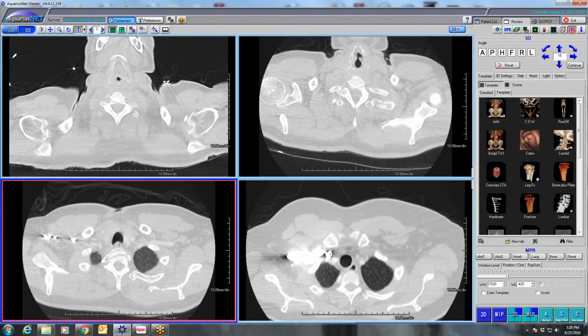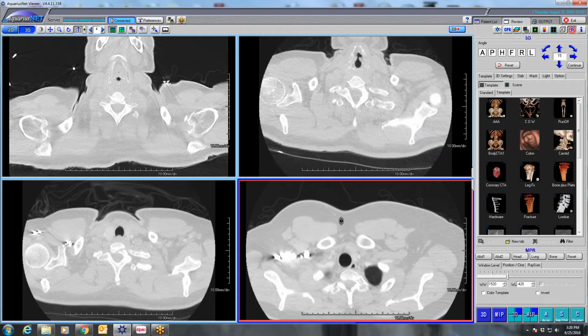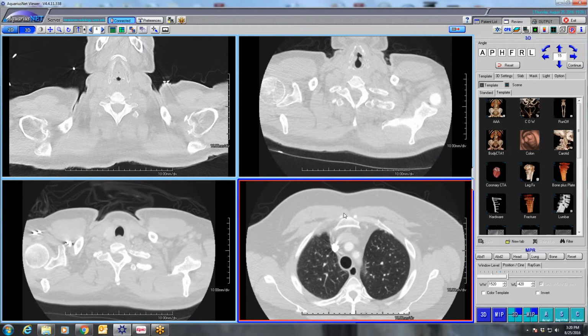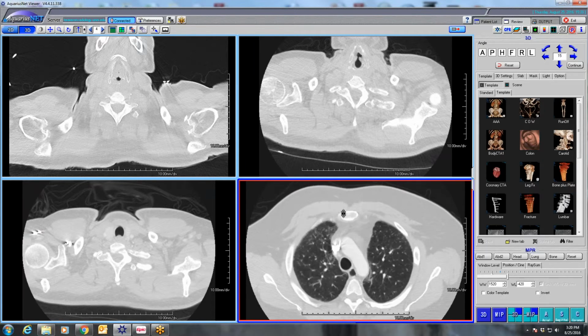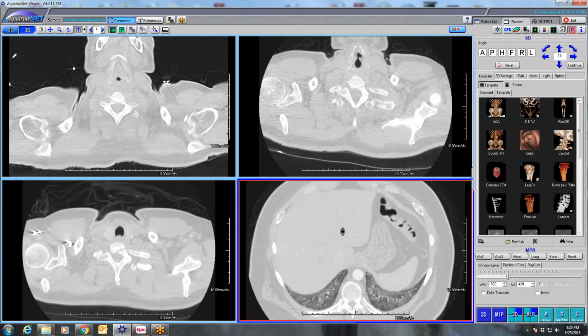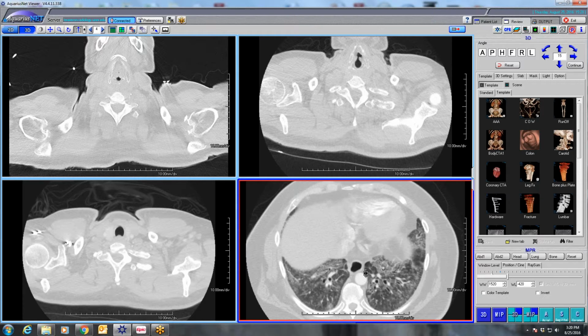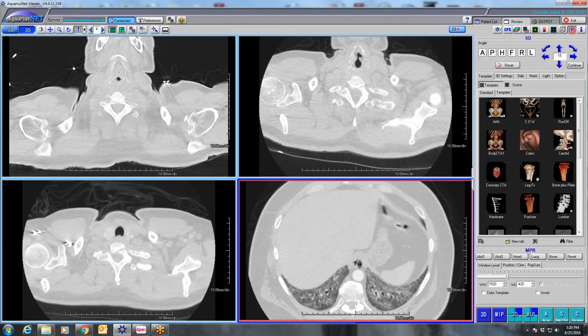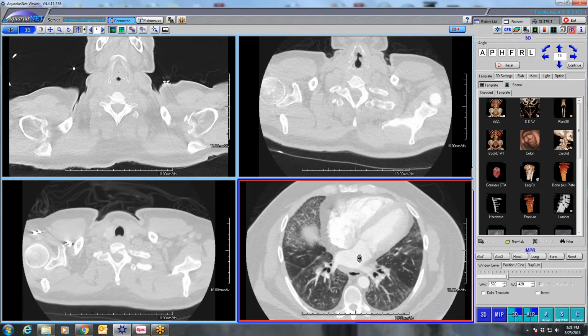All right, so this is a guy with connective tissue disease, scleroderma. This is going to follow a little bit of a trend I'll show on another case. So this is a guy who has diffuse parenchymal lung disease. I think it's pretty classic for NSIP, but whenever I see this degree of ground glass associated with it, I always think that's pretty much, in most instances, some superimposed areas of organizing pneumonia.